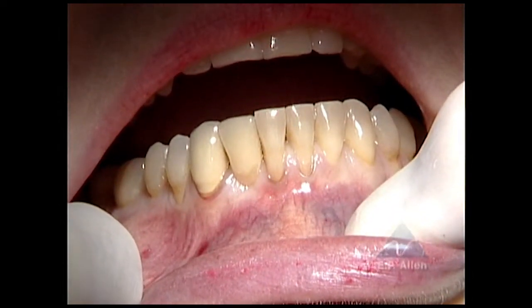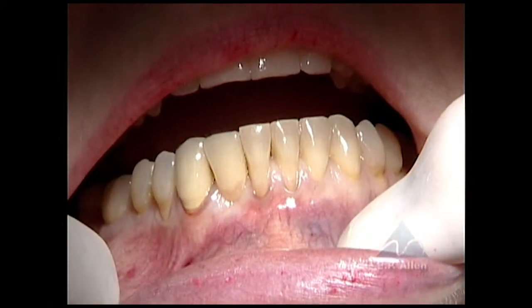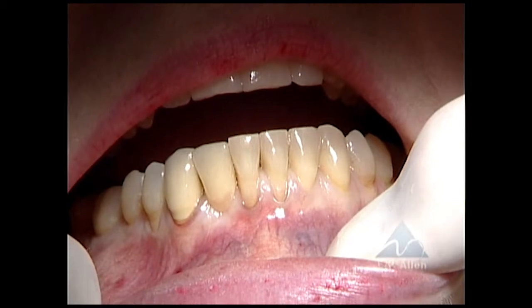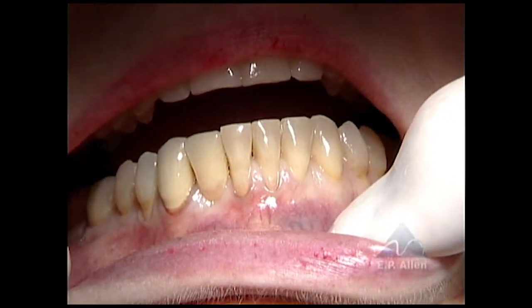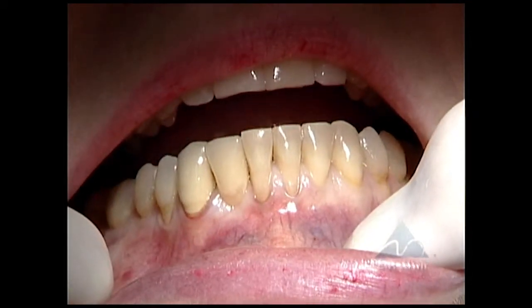Very slight recession but very thin tissue on the canine, and then recession on premolar number 28, a little bit on 29 as well. Tooth 30 seems okay. So I might include 29 in the procedure.